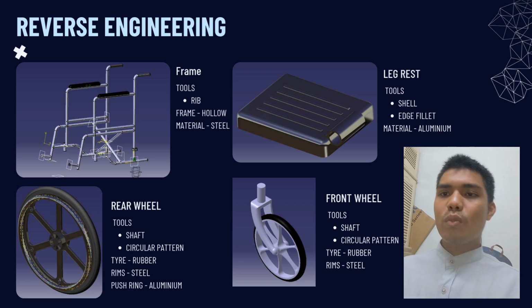For the modeling, we use a tool called rib to make a hollow frame, and we use steel as the material for this frame.